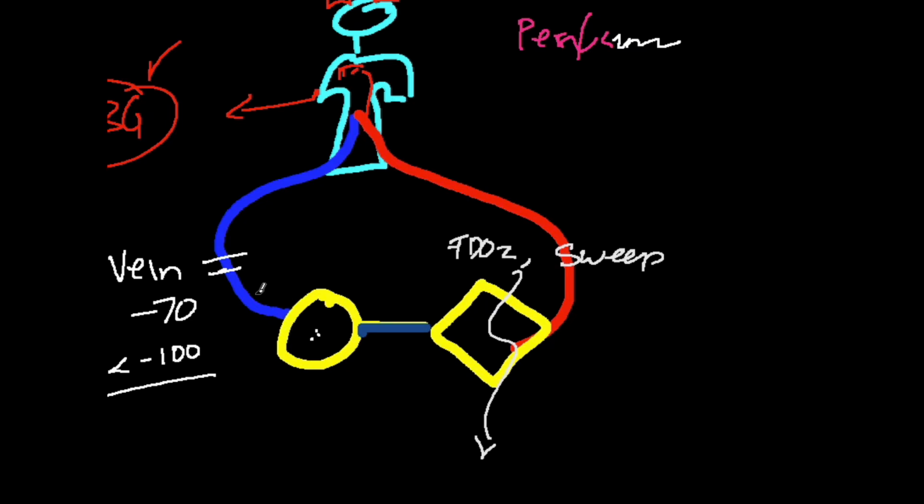And then the pump will deliver blood to the oxygenator at a certain pressure, and there'll be a pressure drop and it'll leave at a certain pressure. Comparing these two, called delta P, also tells you a little bit about what kind of resistance you're encountering in your oxygenator. You don't expect much delta P early on in a run, but say a week or so into someone being on ECMO, this might actually increase.